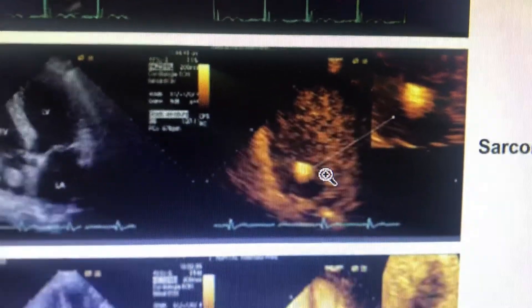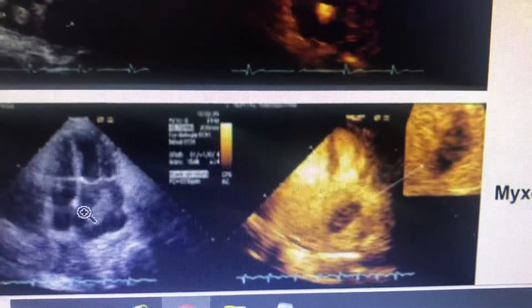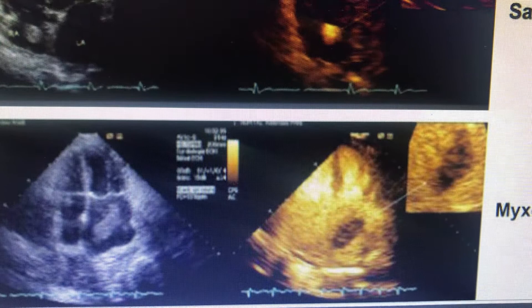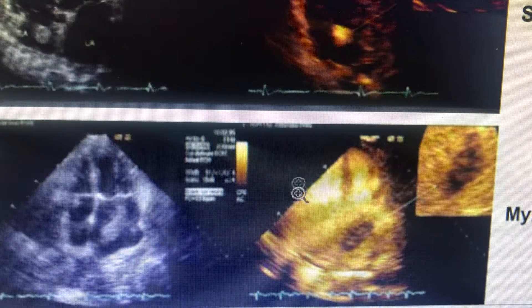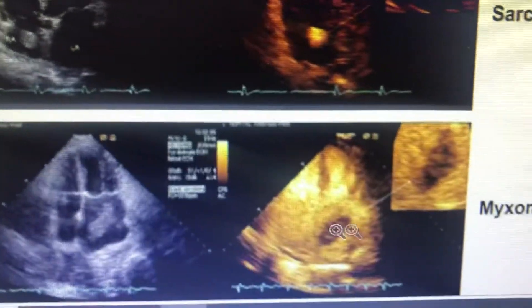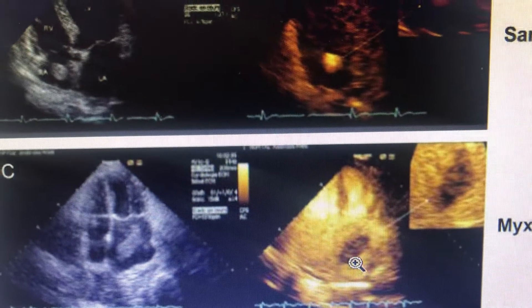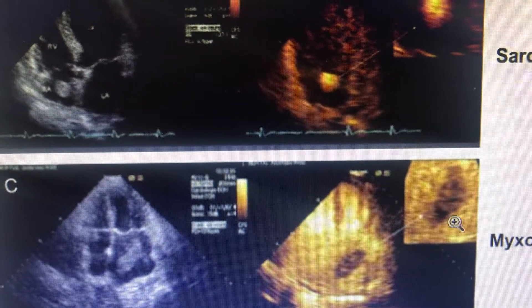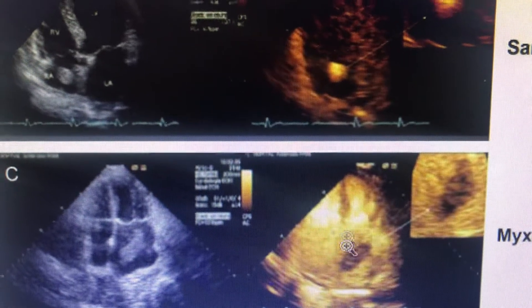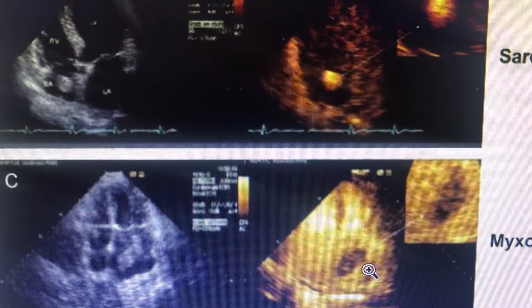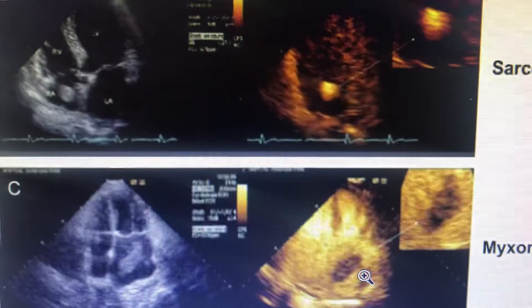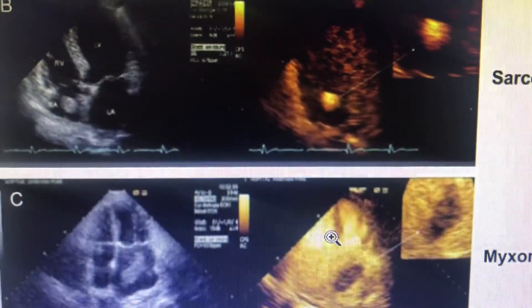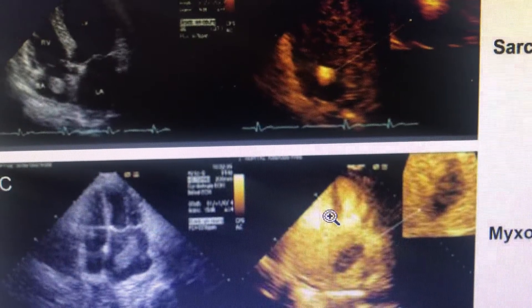If you have a mass in the left atrium with a pedunculated attachment to the interatrial septum, and on contrast echo you see slight vascularization, it is most probably a myxoma. Myxoma shows partial vascularization on contrast. We already discussed contrast echo in previous videos — you can go back to those. Thank you.